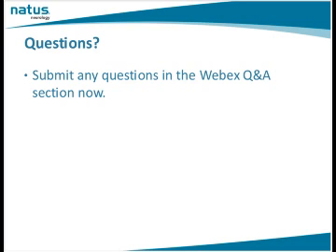The things that we talked about earlier, when you're learning to find the PCA, have your patient close their eyes. And then when you're on what you believe is the PCA, have them open their eyes as you turn on the lights. Wait about usually 5 seconds, and you'll see an increase in flow. And then when you turn off the lights, you'll see the flow go back down.